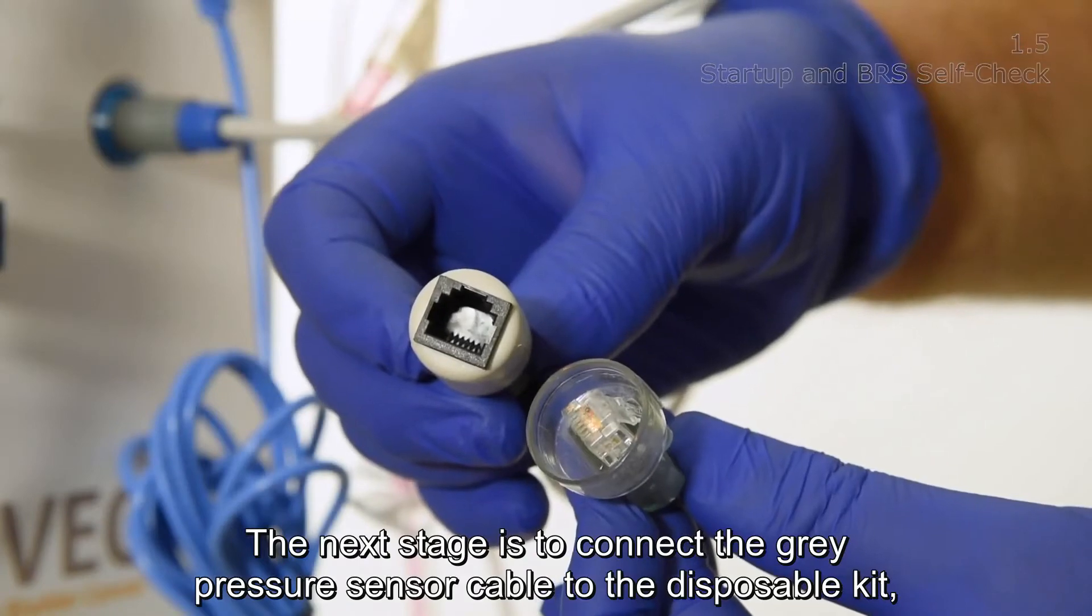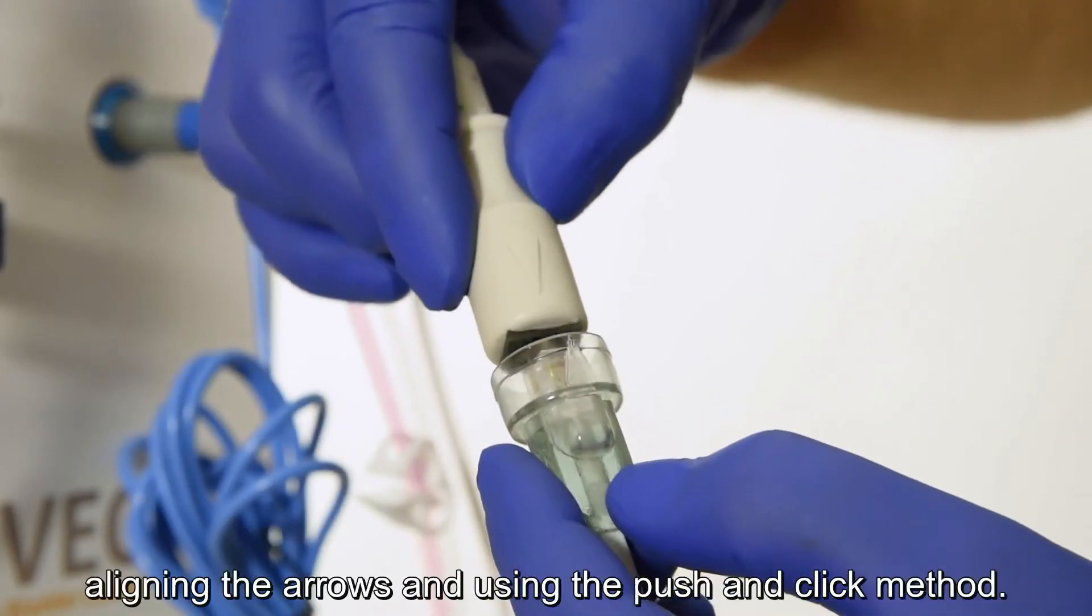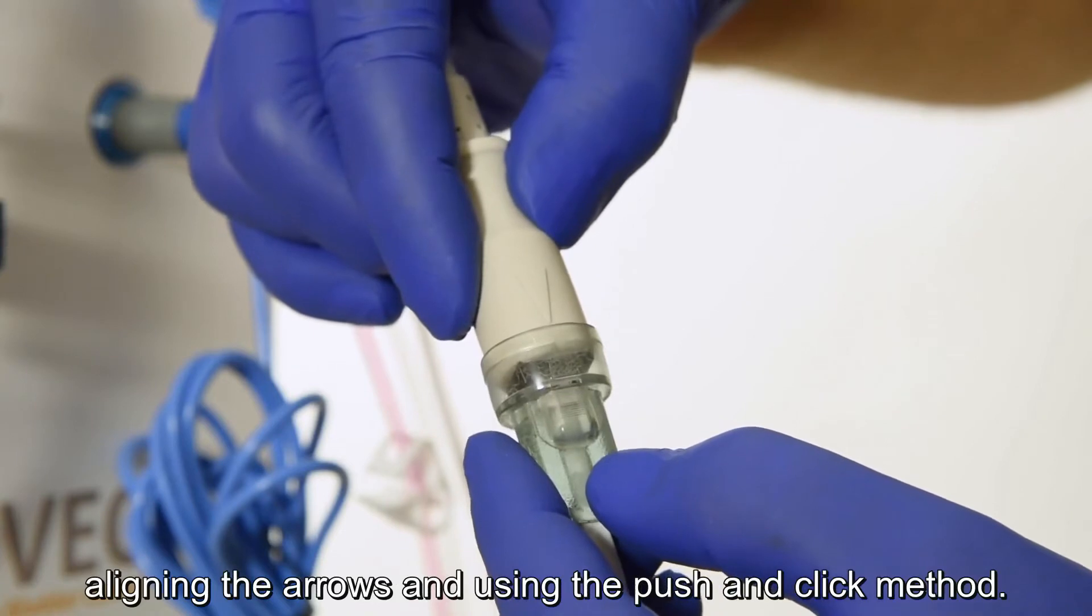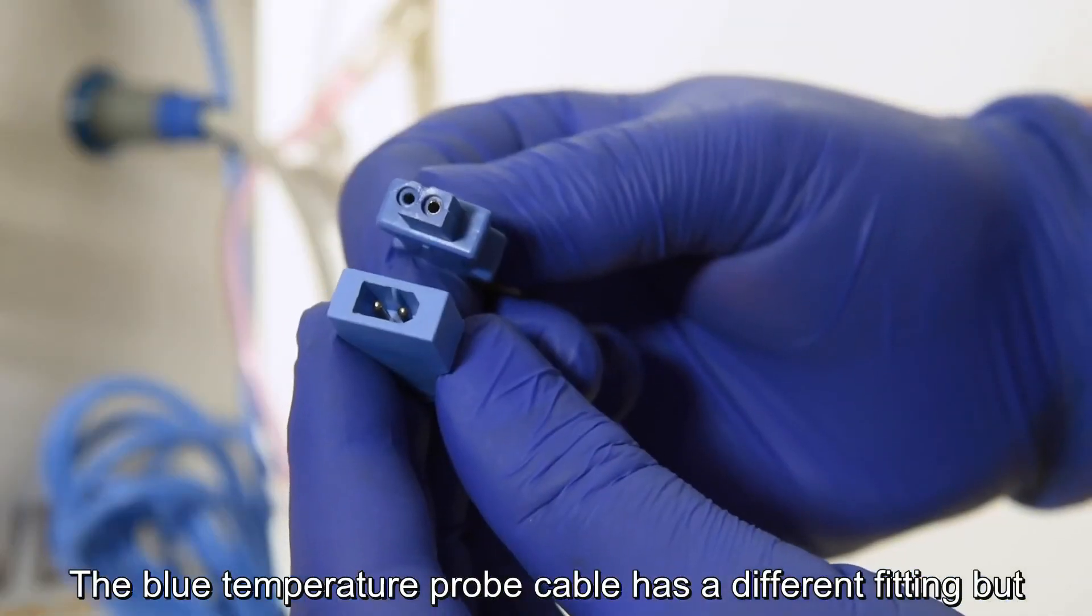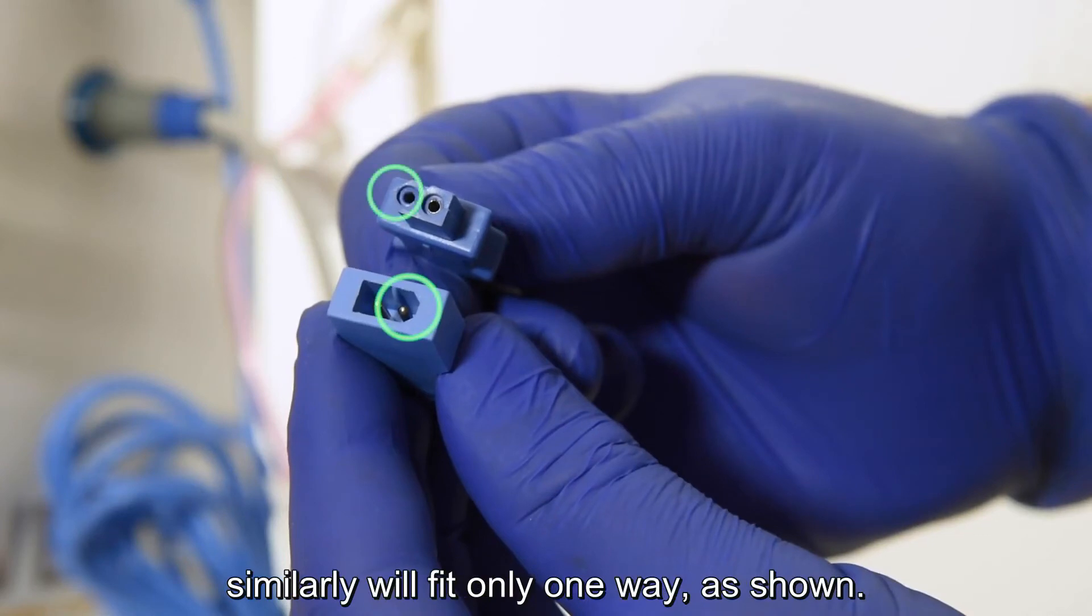The next stage is to connect the grey pressure sensor cable to the disposable kit, aligning the arrows and using the push and click method. The blue temperature probe cable has a different fitting, but similarly will fit only one way as shown.